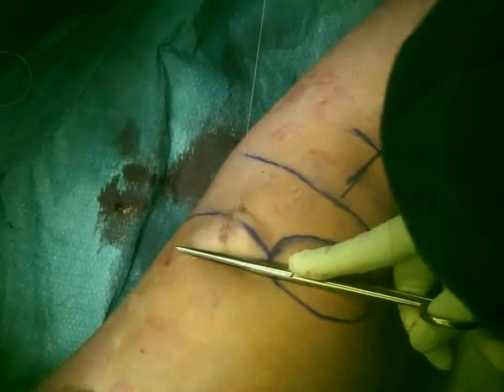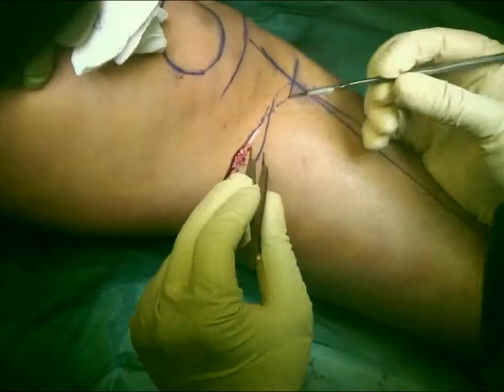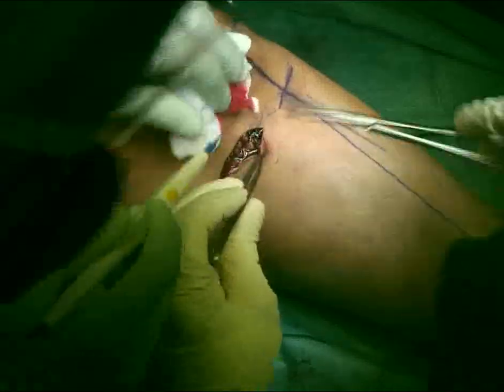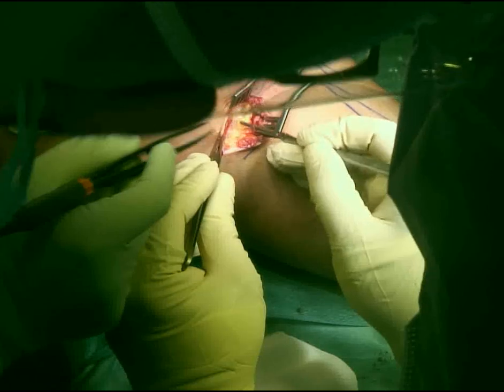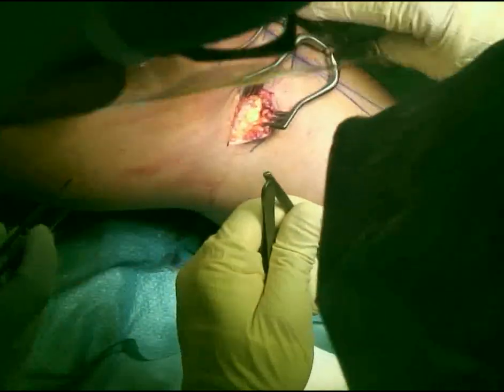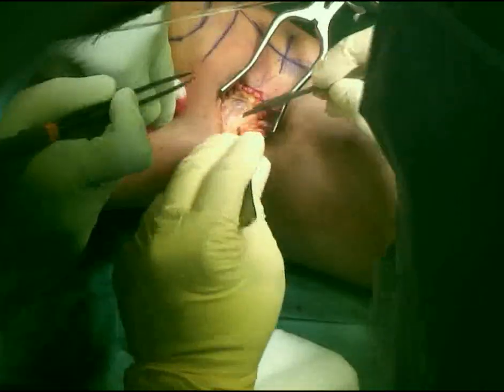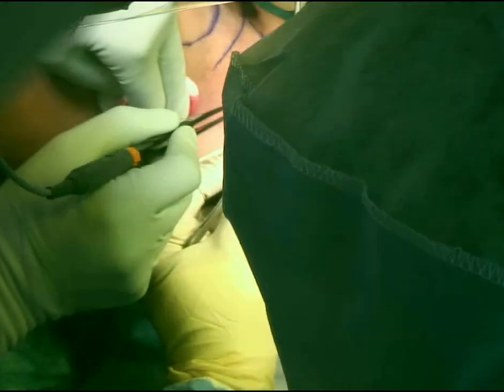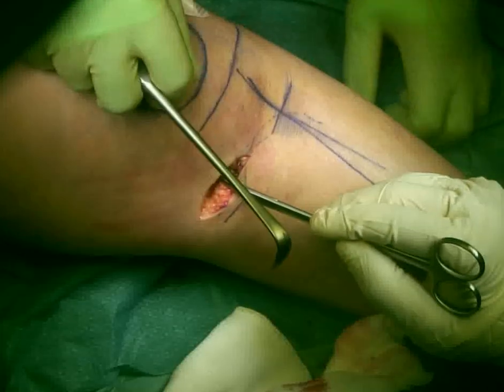As for the hemiplateau elevation, I usually use a horizontal incision, and this is placed at the level of the axilla of the depressed hemiplateau. We need to be careful with important structures here, like the saphenous nerve, the great saphenous vein, and the hamstring tendons. That's one of the reasons why I changed my practice and now use a more vertical incision, which is more friendly for these structures, and I try to get them away from my osteotomy. Also, using a vertical incision gives me the advantage of doing the tibial osteotomy through the same incision.